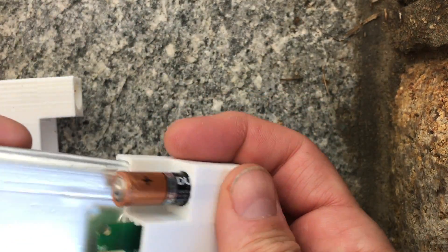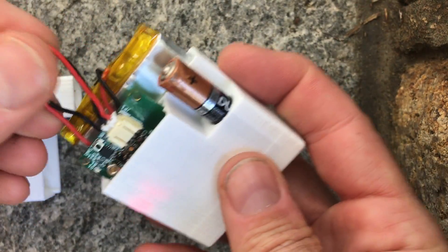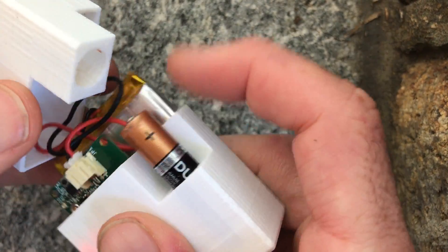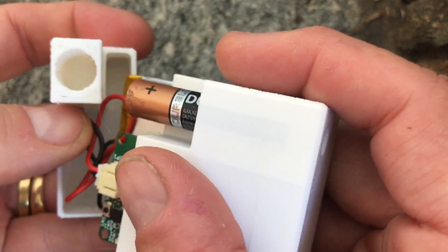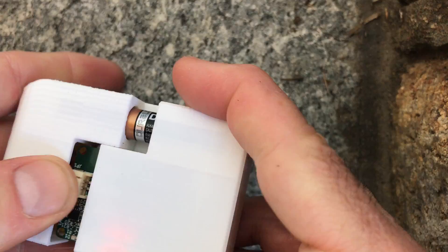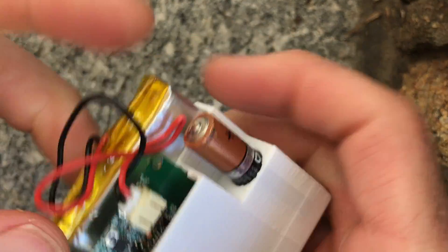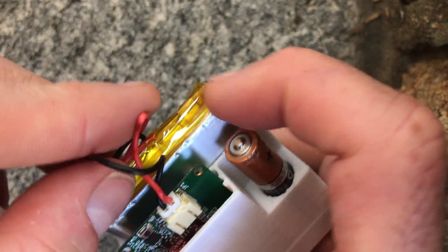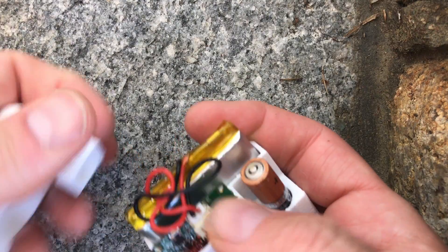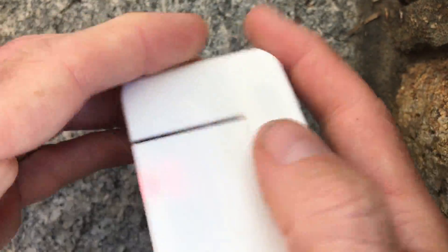Now you can plug in the battery and the LED lights up. There's some room for the wiring in the top. If you put it all together and it doesn't close, it's because your wire is getting caught, so you just have to move it to a good location that's not under this. So there you go.